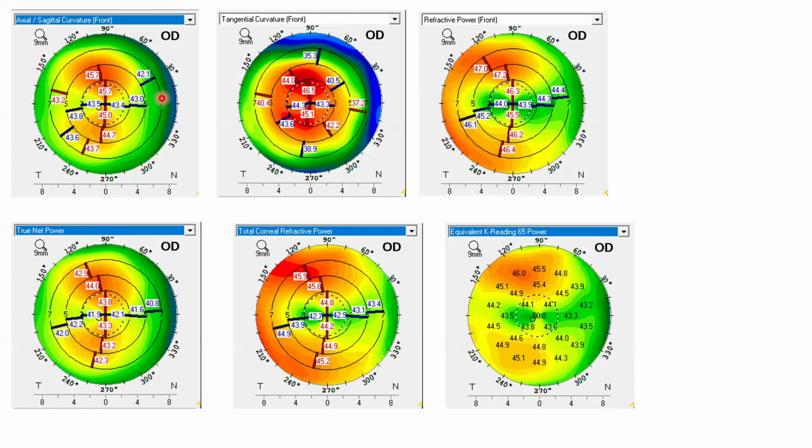I wanted to ask you here that Scheimpflug has been around for 15 years, and of course it works great like you've shown. Do you think OCT, AS-OCT derived corneal powers and keratometries are more accurate than even Scheimpflug, or are they less accurate?